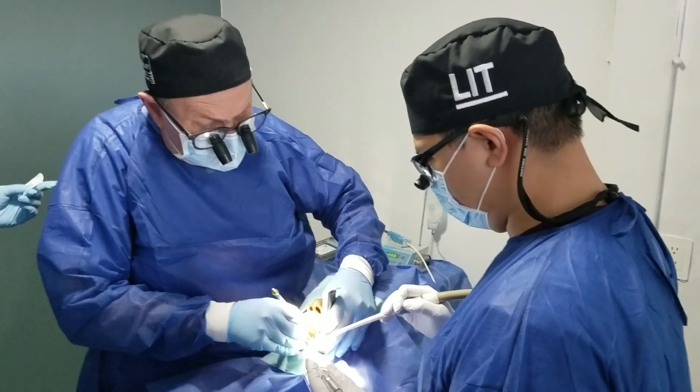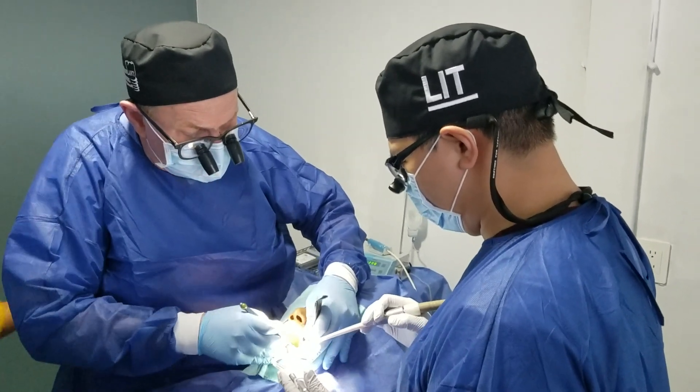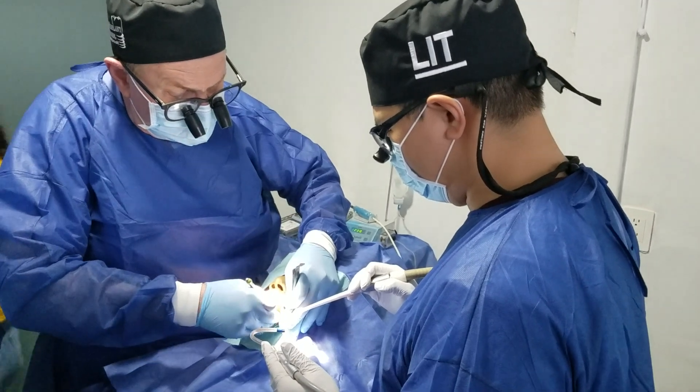Yeah, this thing really does a great job luxating on the mesial to get this molar moving. Good feel to it.